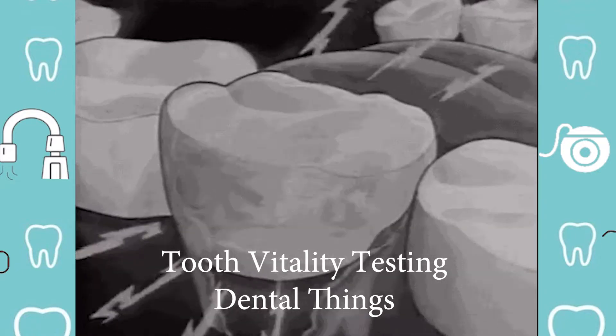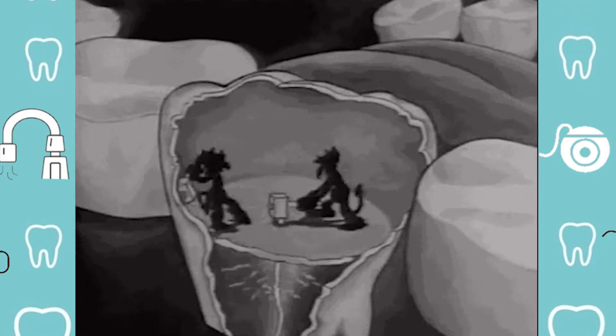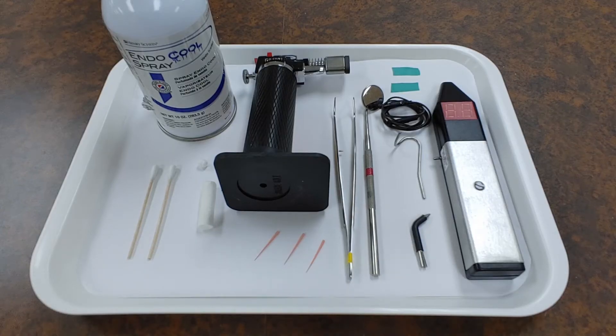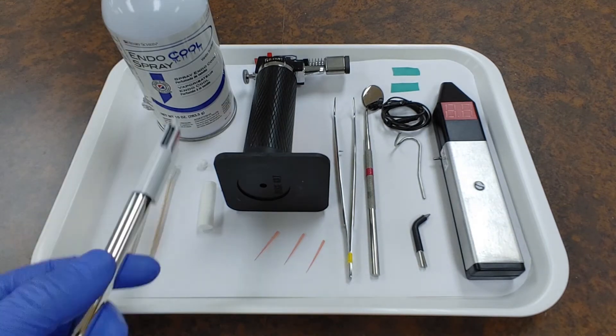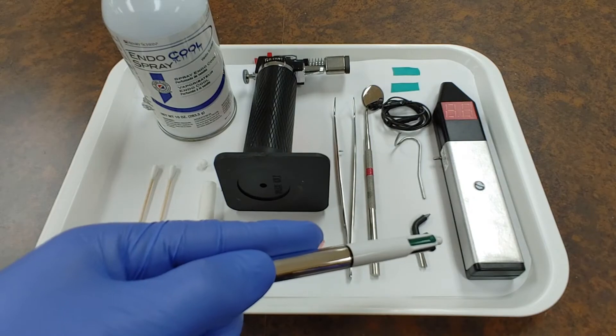Hello everyone. Today we're going to be going into vitality testing of teeth and the different methods we may use to do so. Here's a tray with a couple of different methods that we can use such as heat, cold, palpation, percussion, and electric pulp testing.